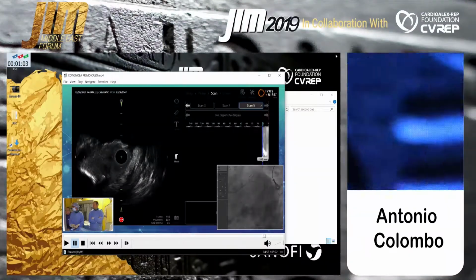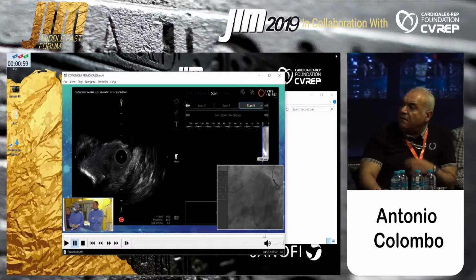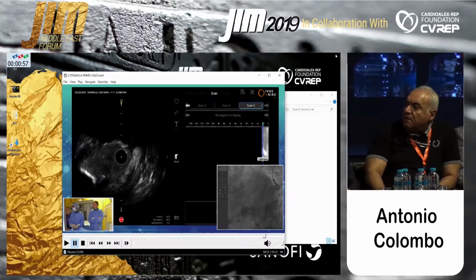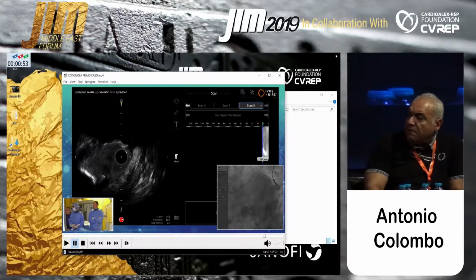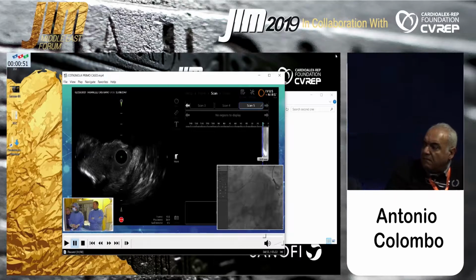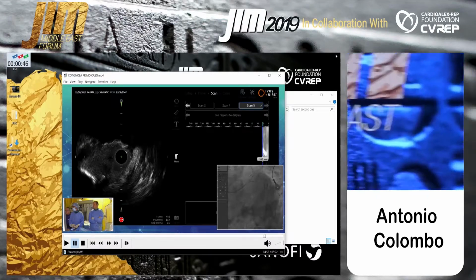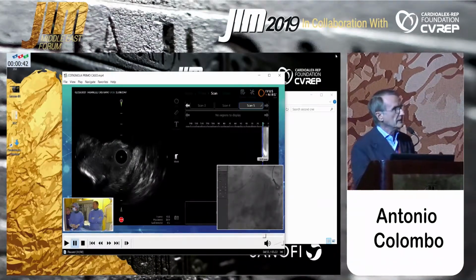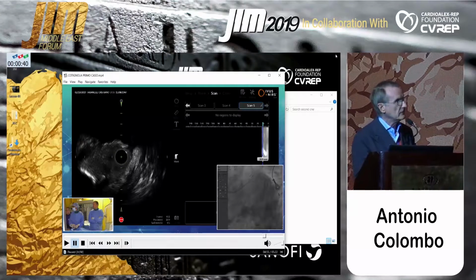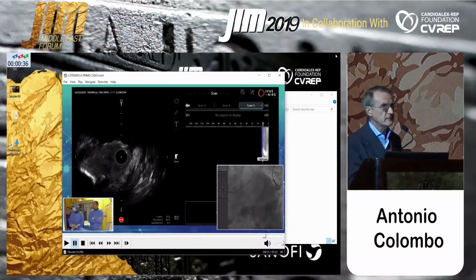One-to-one, except with a cutting balloon at high pressure. With the cutting balloon at high pressure, we undersize because the cutting balloon at high pressure is compliant and then becomes one-to-one, because I go to high pressure. I dilate one-to-one because my goal is not to place a stent. My goal is to have optimal predilatation without being sorry if I have to place a stent.